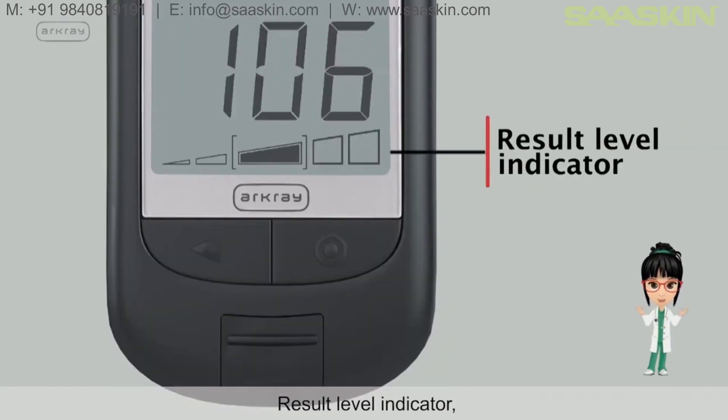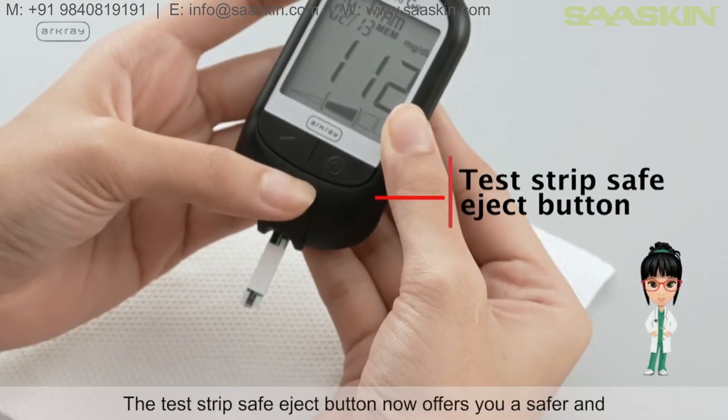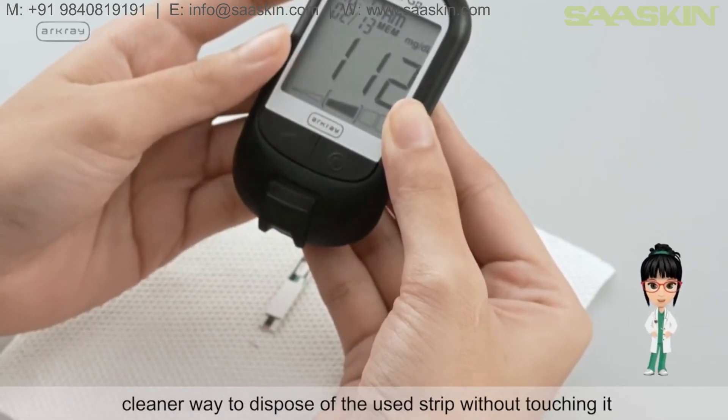The Result Level Indicator classifies test results into various levels for easy interpretation. The test strip safe eject button offers a safer and cleaner way to dispose of the used strip without touching it.